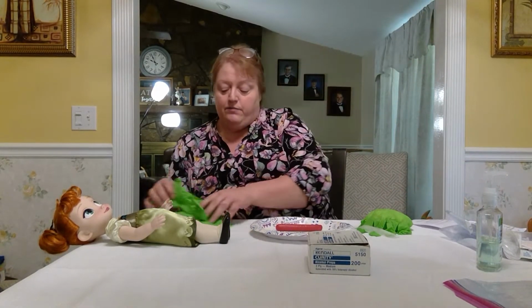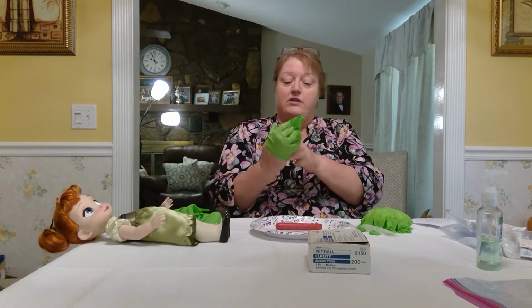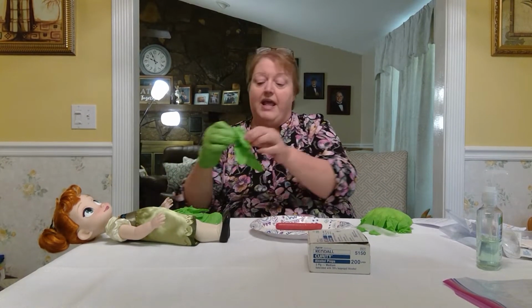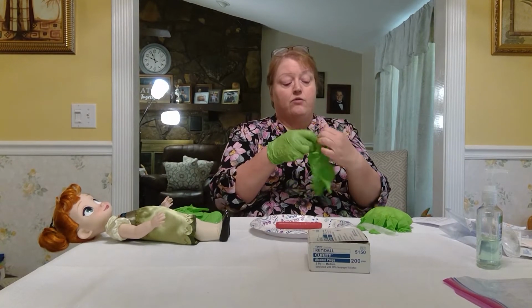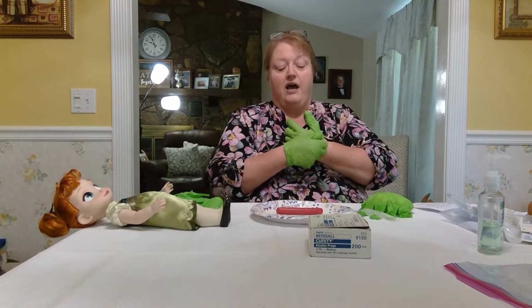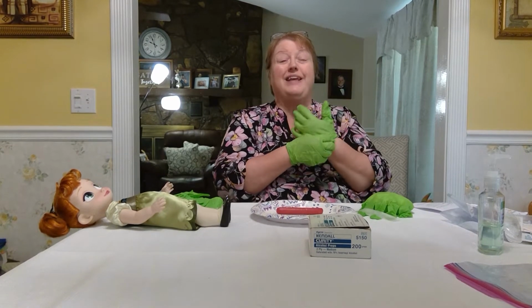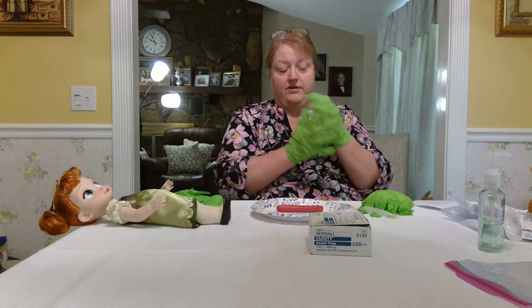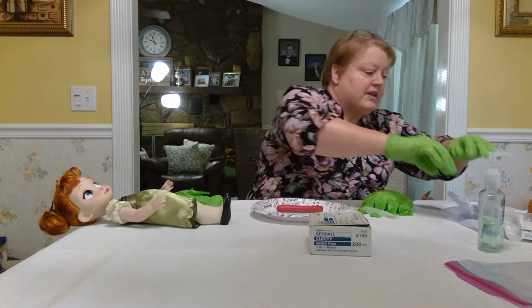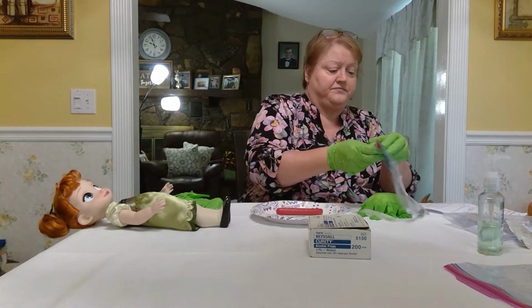So in the patient's room, I'm going to put on gloves, instruct the patient that I'm going to be giving an intradermal medication. And when you complete your video, you're going to be showing us on another person the different locations. So I'm not going to get into that in this demonstration, but you will be doing that tacked on to the end or the beginning on where intradermals can be given. That will be a separate video that Ms. Cusinelli will be doing. Okay. Find your tuberculin. That's the first thing I'm going to be giving.